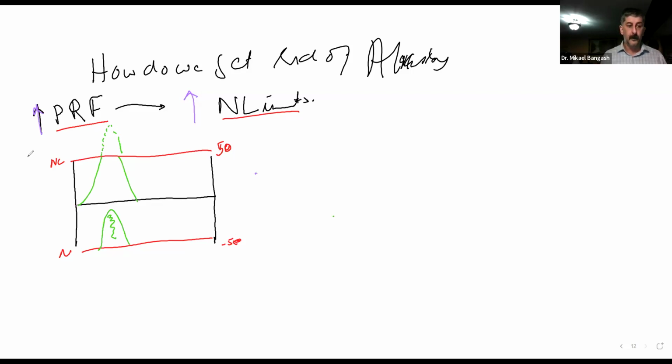So what happens when we increase the PRF?